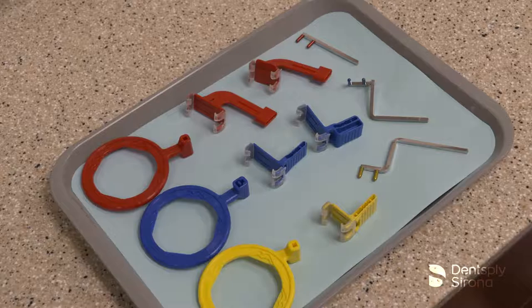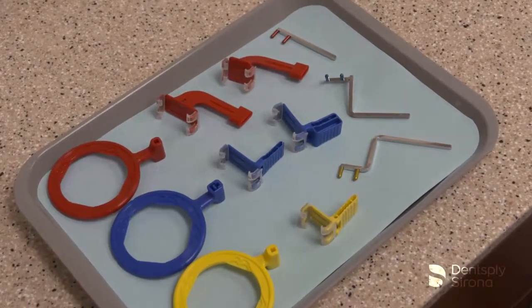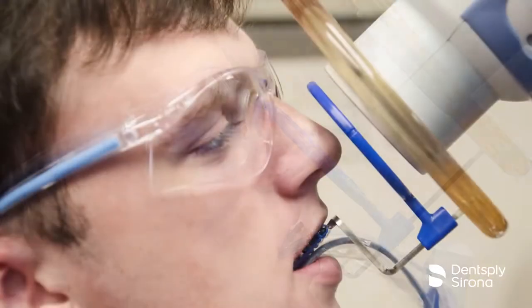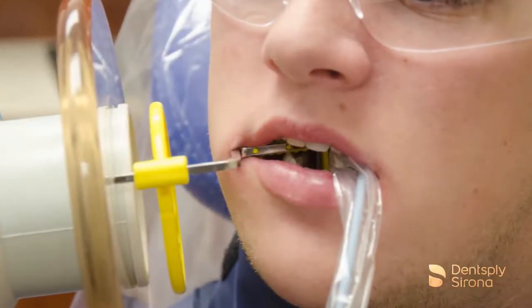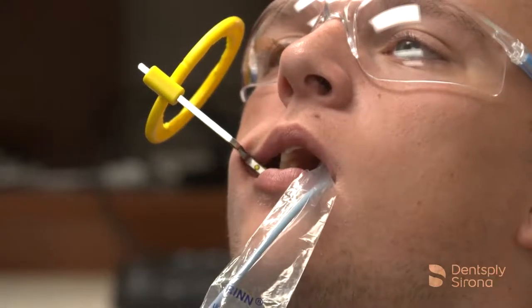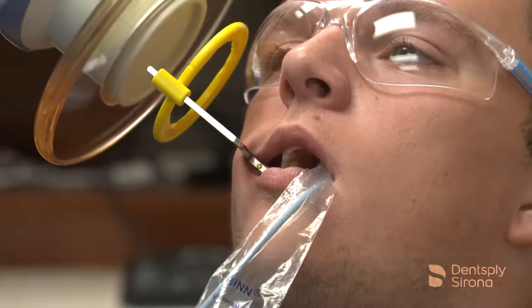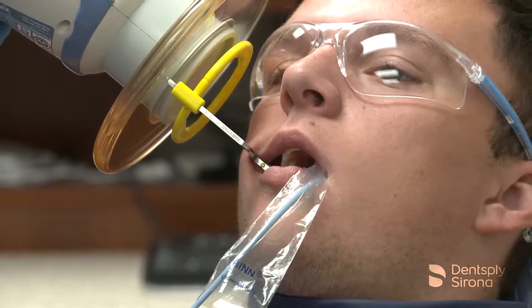RIN's XCP short arm aiming devices were designed for use with handheld portable x-ray units. The XCP short arms are up to 48 percent shorter than RIN's standard XCP arms, enabling closer positioning to the patient's face. Using the XCP short arm makes it easier and faster for the clinician to align the handheld x-ray unit accurately than if an aiming system wasn't utilized.